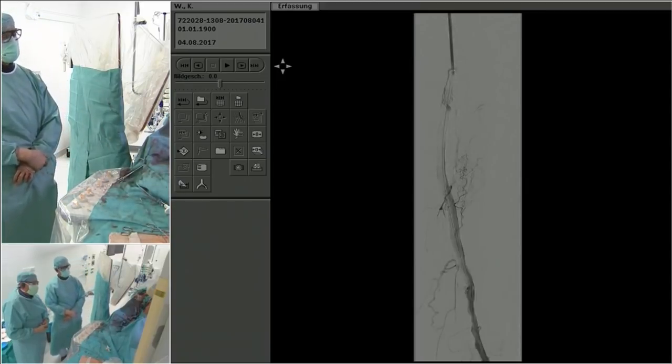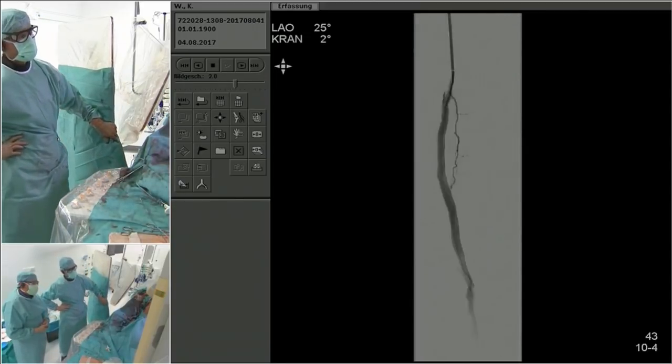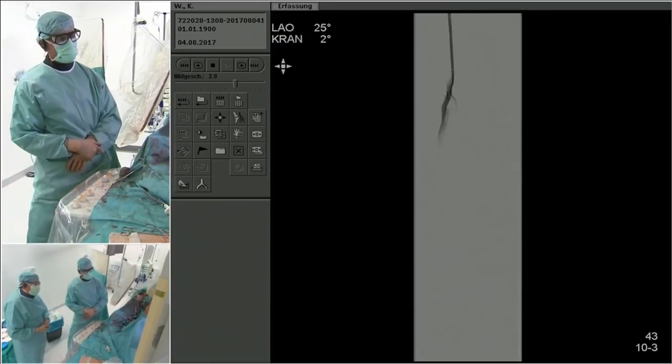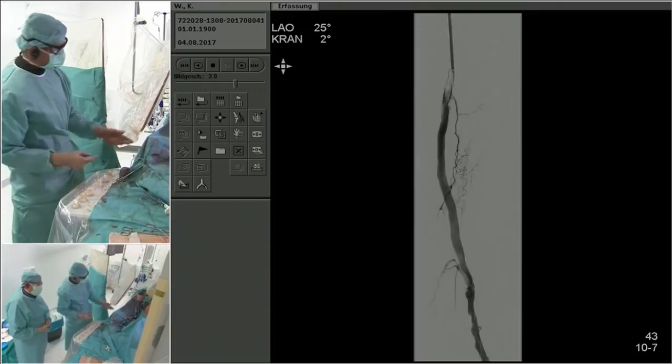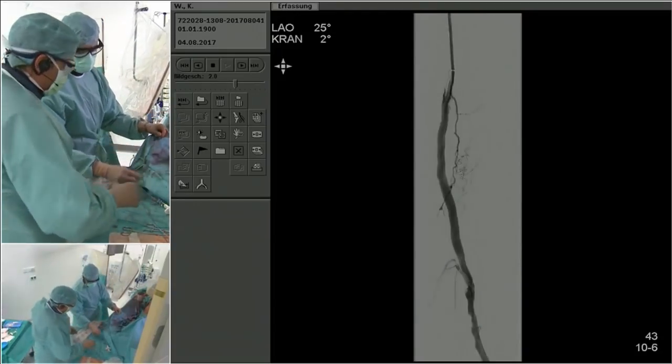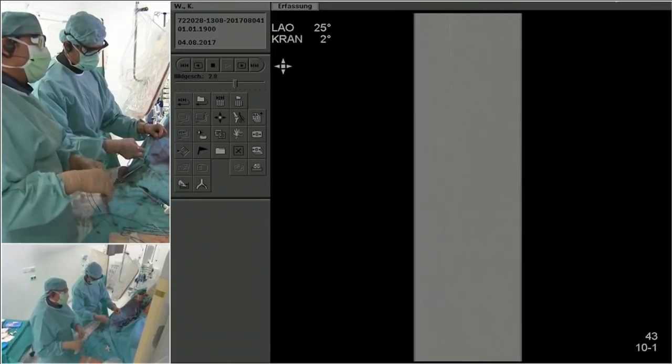Well, that regard is very simple. You can just sort of see if you feel a pulse. If the patient has a pulse back in their foot now, I mean, this looks pretty amazing. Obviously we have to be resource-minded as well to start opening additional stents without additional reimbursement, without clear benefit. I think that is something I'd stay away from.